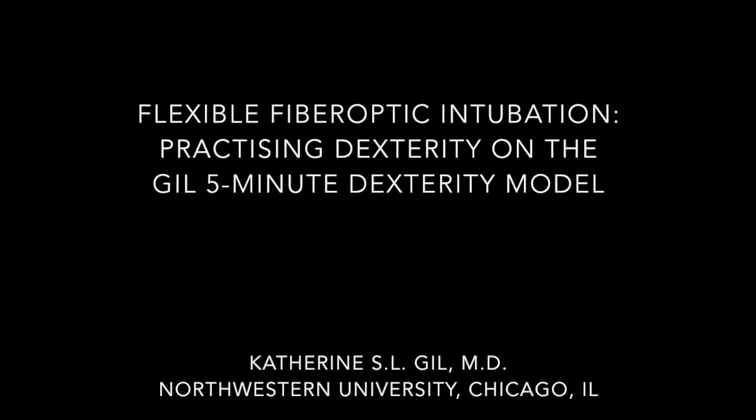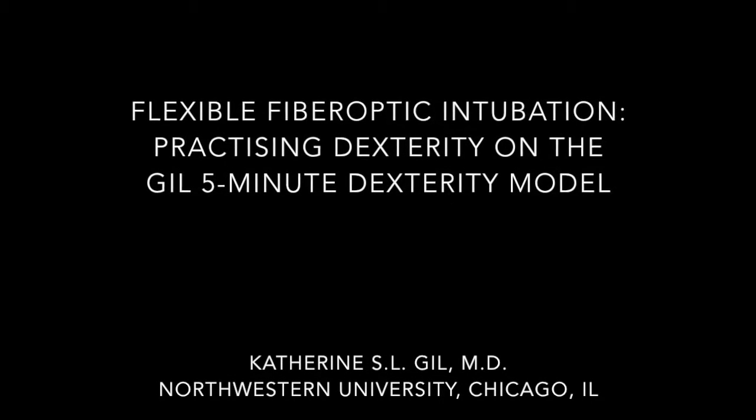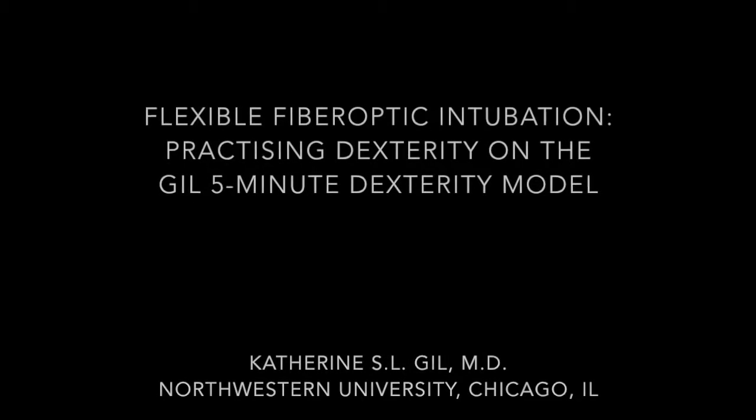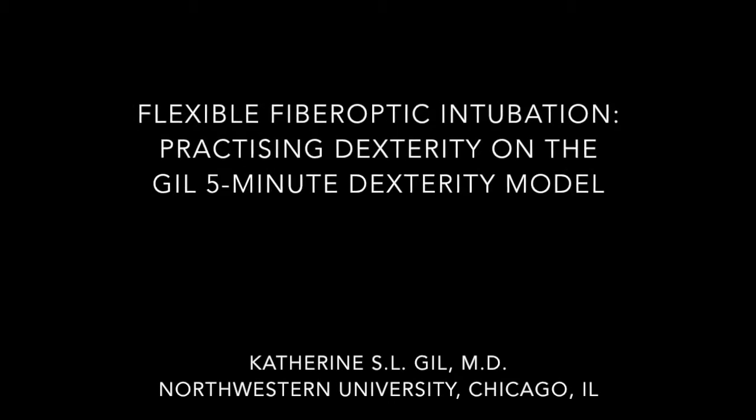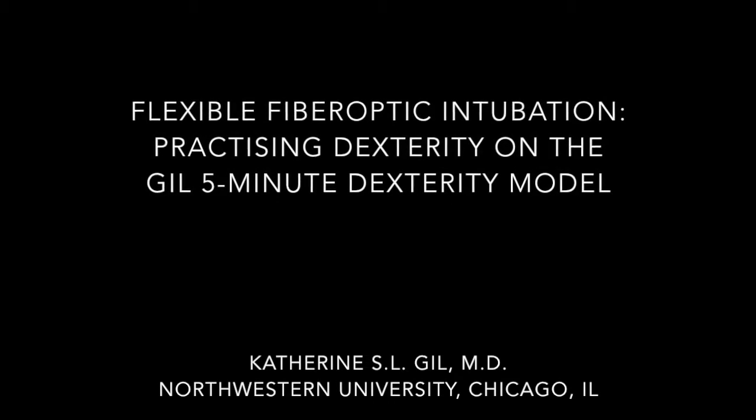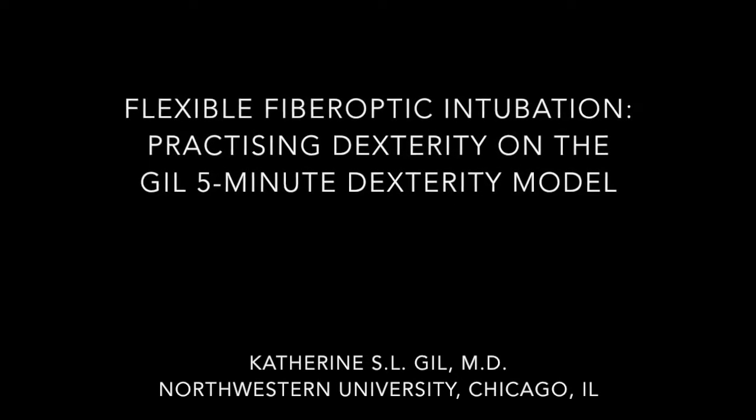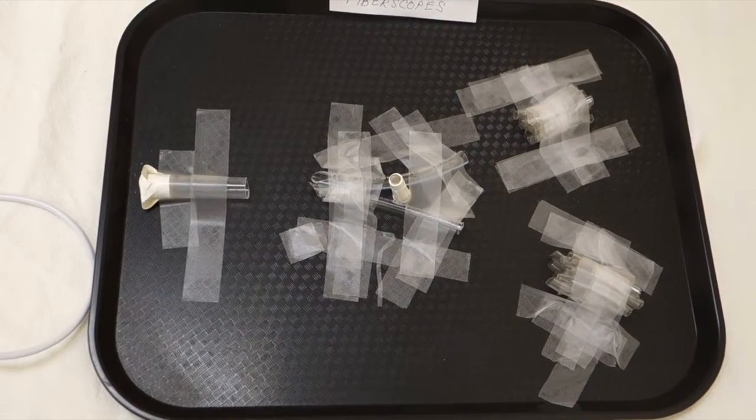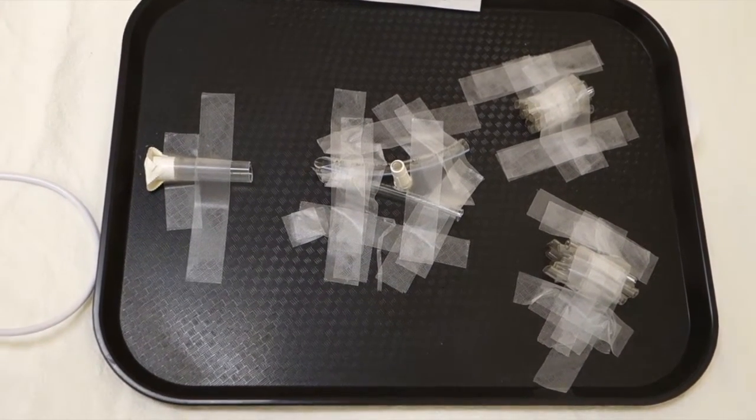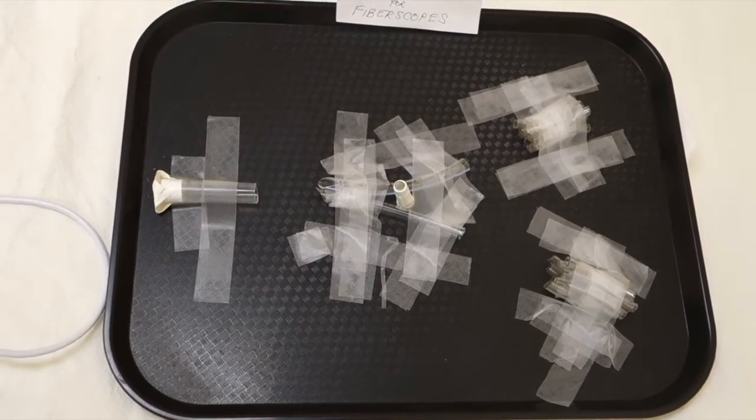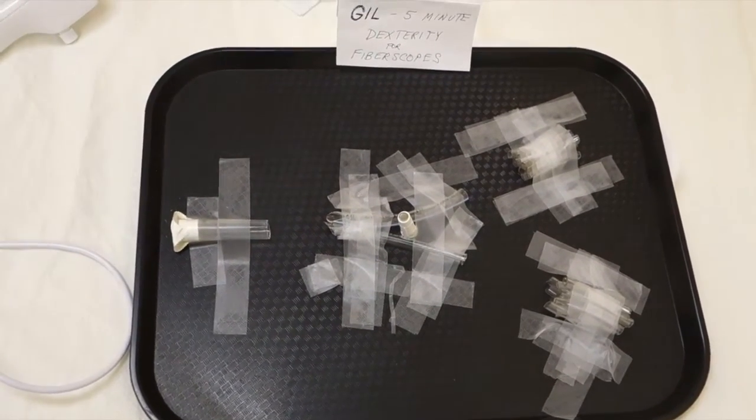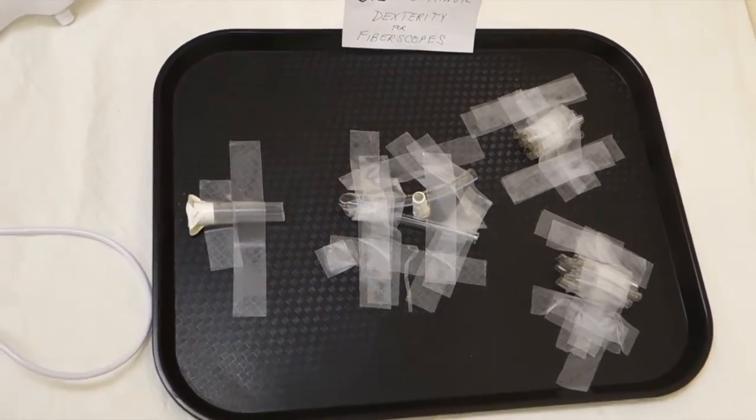Practicing dexterity on a Gil 5-minute dexterity fiber optic model. Keep view central and make small moves. I'm using a flexible non-fiber optic scope, but for simplicity's sake, I'll always be saying fiber optic.